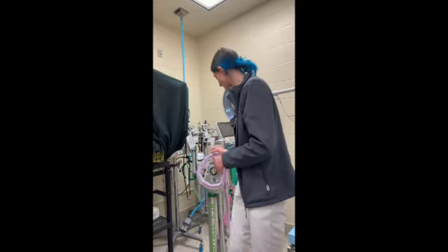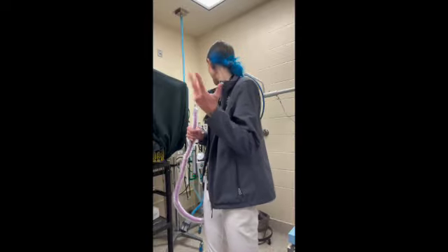Non-rebreathing circuit, it's typically going to be used for patients that are about 7 kgs and under. I don't actually have one to demonstrate, so I apologize, we're just going to talk through it.